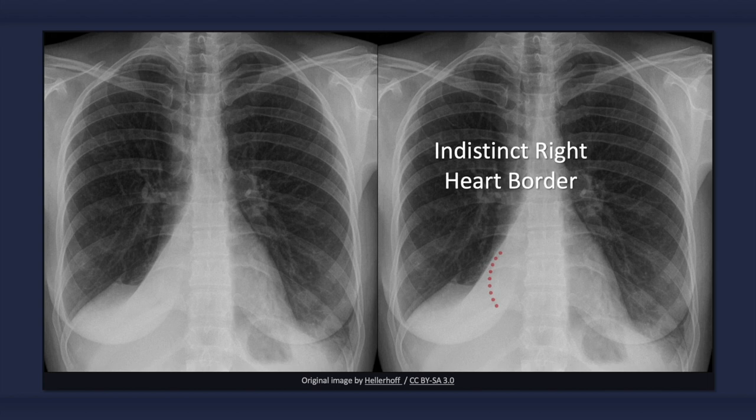Collapse of the right lower lobe results in effacement of the right heart border, obscuring the interface between the lung and the heart. This is referred to as the silhouette sign. Note that the interface between the lung and the medial aspect of the right hemidiaphragm is also obscured.